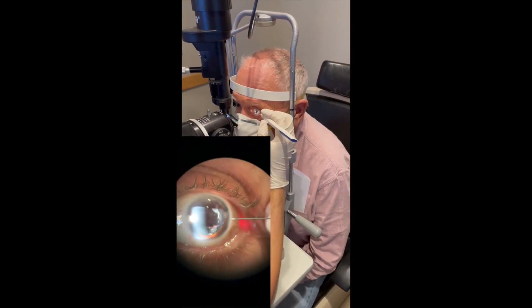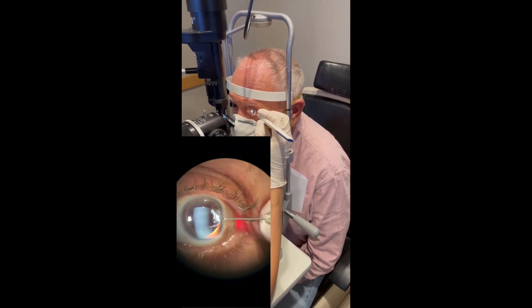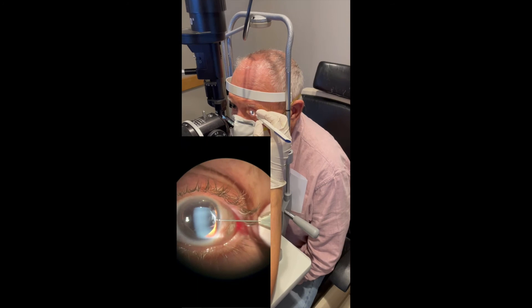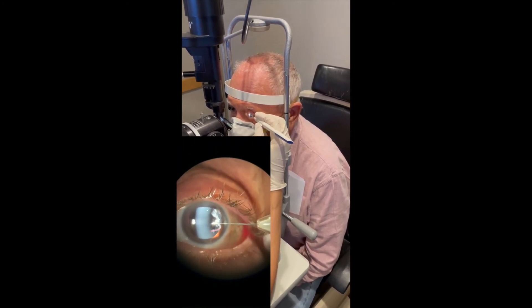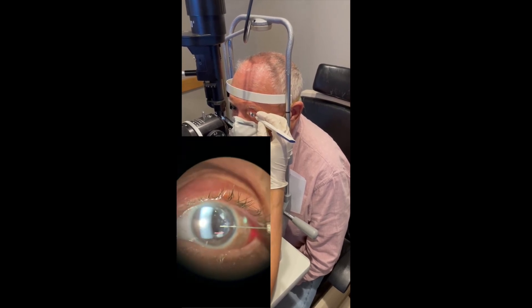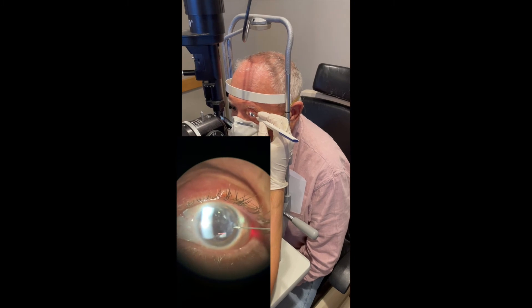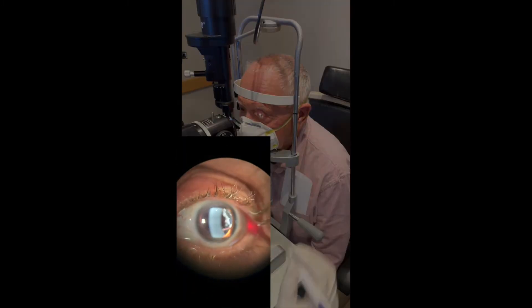The ideal placement is through the temporal clear corneal limbus. What I prefer to do without a speculum is enter without any counter traction, cross midway through the pupillary axis, and then push the button. The implant injects and falls to the inferior angle. The injector is removed and the procedure is complete.